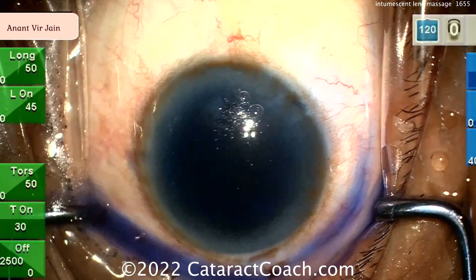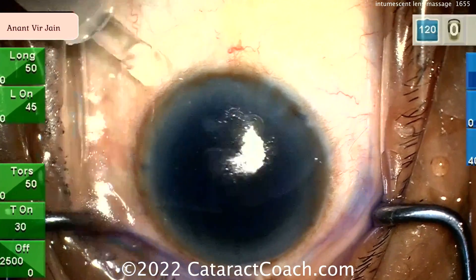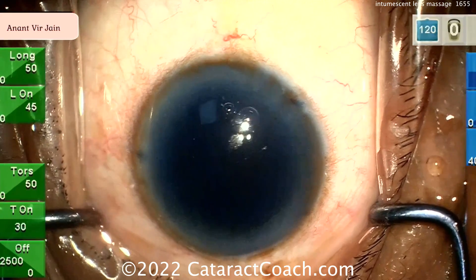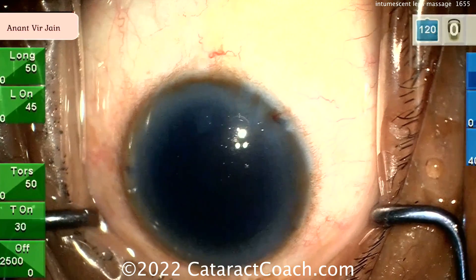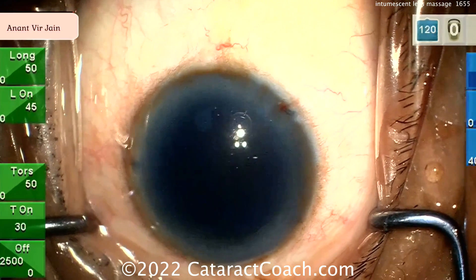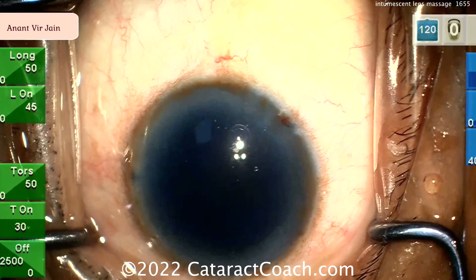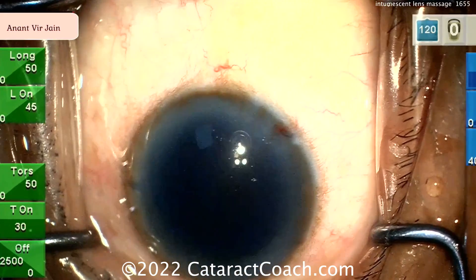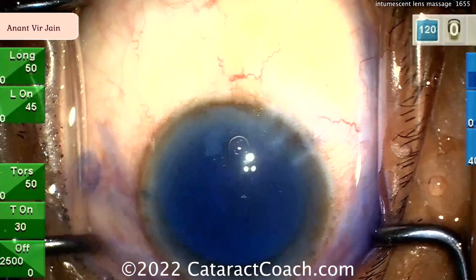Here's another one — intumescent white cataract with trypan blue dye going in, and then again a lens massage. The idea behind the lens massage is that with the closed bag, you haven't opened the capsule bag yet — you just want to make sure there are no loculated pockets or pressure-filled areas behind the nucleus. We can do the effect of rocking the nucleus before ever opening the lens capsule.